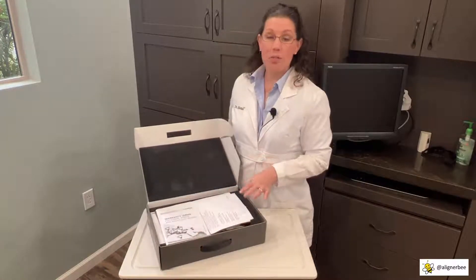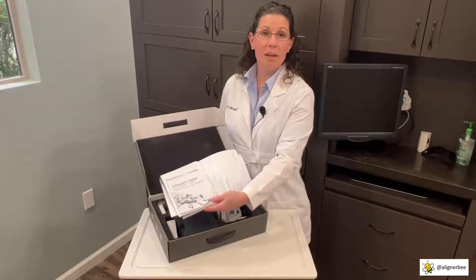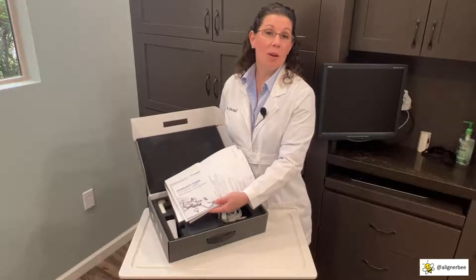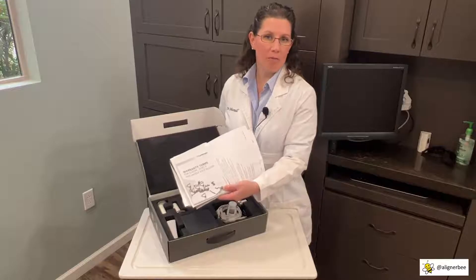When we first open the CS3800, we're going to see all of the user manuals and warranty information. I recommend storing these in the box in a safe place so that you have them for future reference.